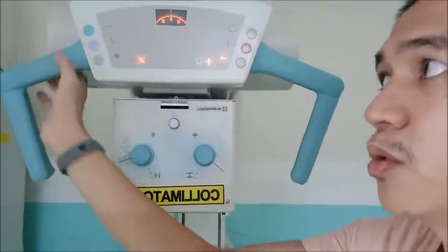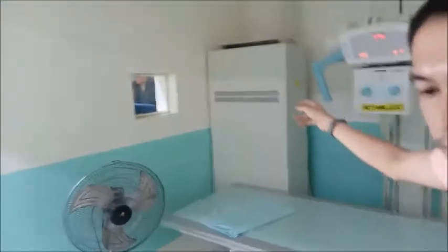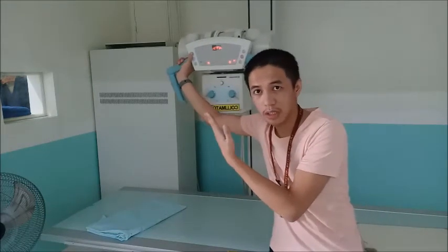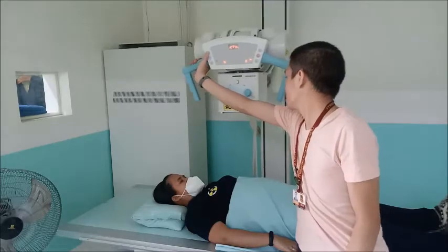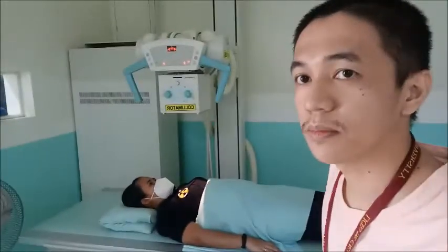So ato na lang movement kung naata sa ato ang table is this one. Pasaka dire. Siya. Sorry. Movement towards ito. And then towards this side. So we have movement, inclination required is for the head. Siya. Pero nasangit naman, atong collimation is nara sa chest area ni patient. Tapos ang imong x-ray tube assembly is dili na siya pwede direct towards dito nga side. So what to do? Just move the table.